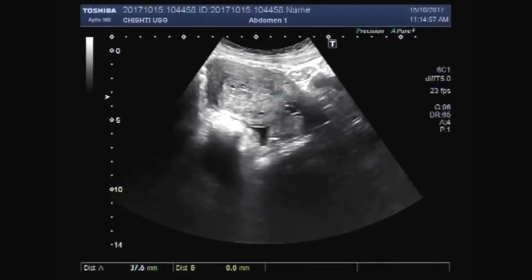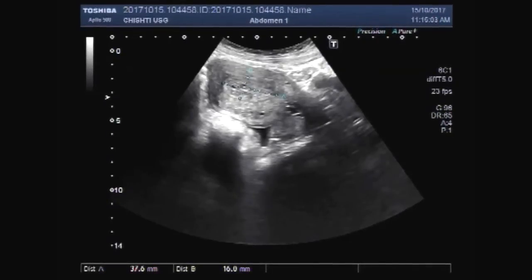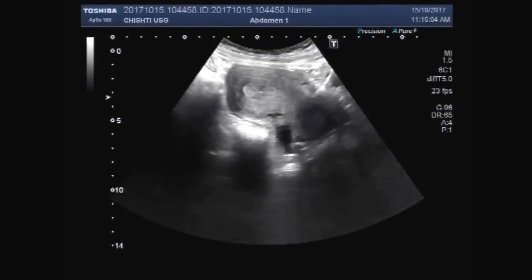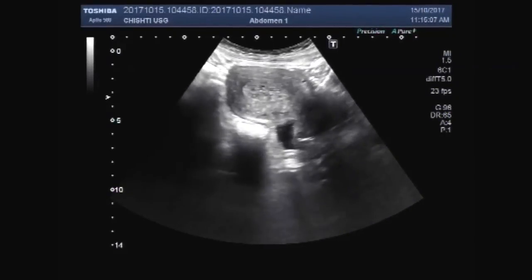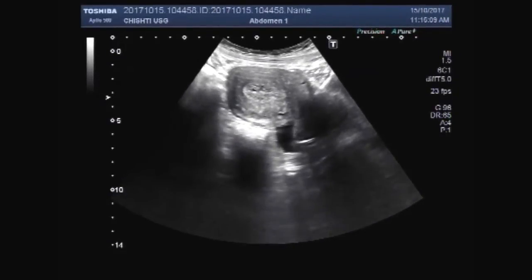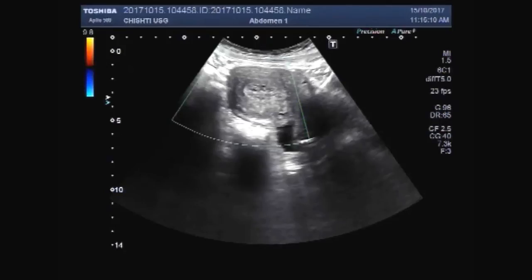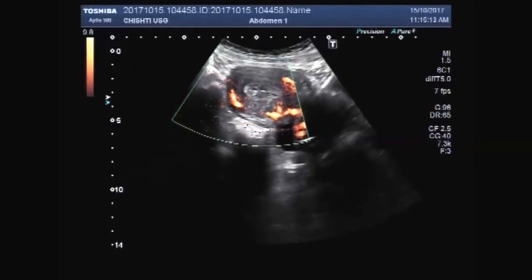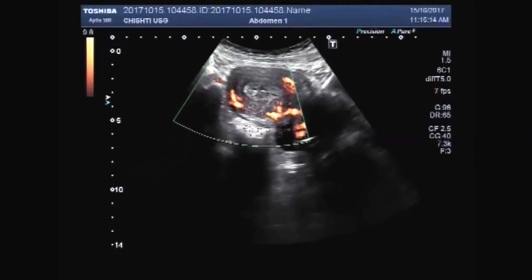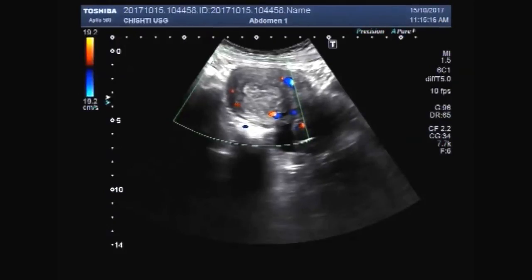Now we measure the polyp. Significant blood flow is seen in the uterus.